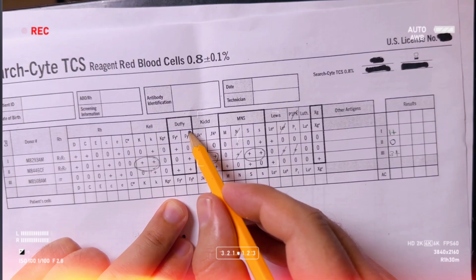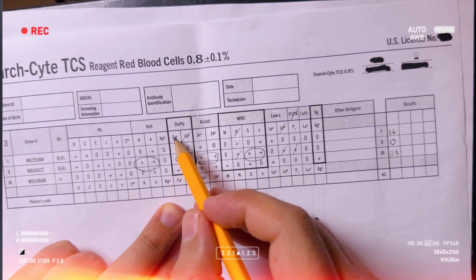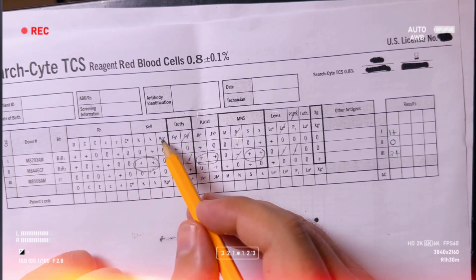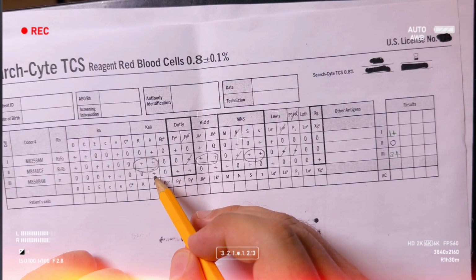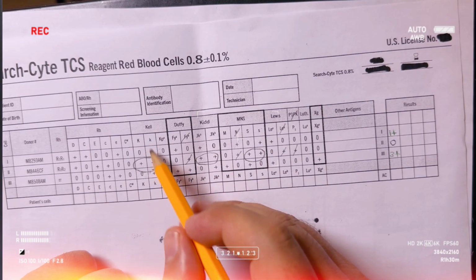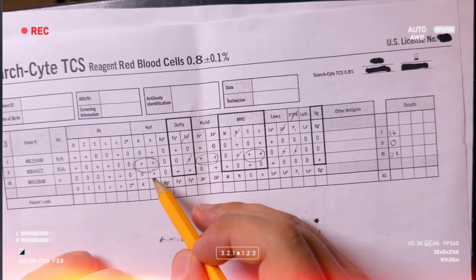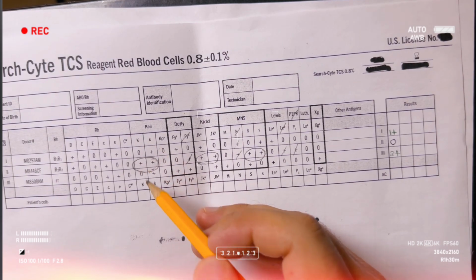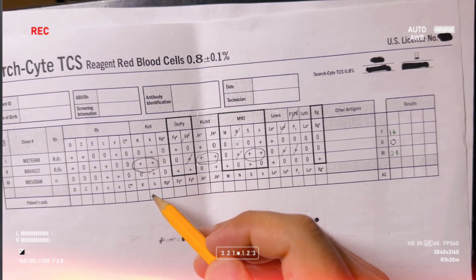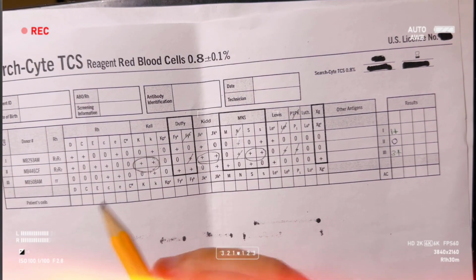For the Duffy antigens, Duffy B I can rule out with a homozygous, but we will leave this for now. This one has nothing. For Kell, I have a heterozygous. There is a separate rule for Kell: if you have a heterozygous, you can rule out big K, but we will go through panel 1 to make sure that everything is clear.